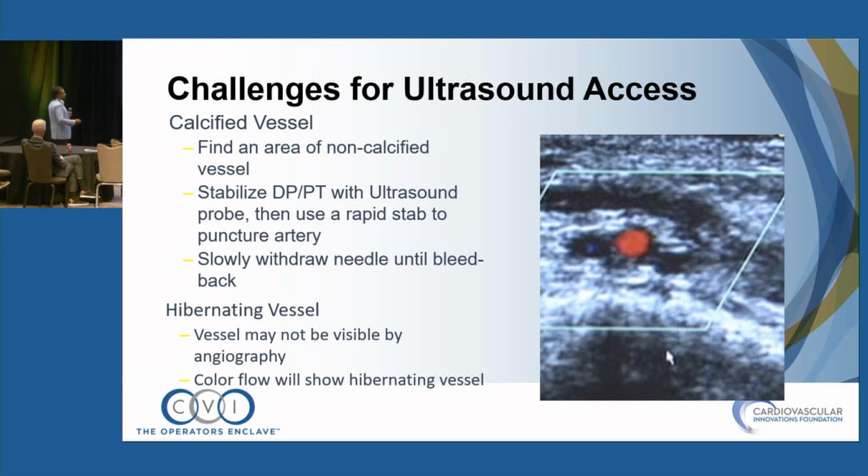That works. And then sometimes you just got to move your needle. Just find another spot. You can do that in the longitudinal view. That's really helpful to do it in that view, because then you can see the artery in different spots and you can get access. The other thing is shallow your needle a little bit more. So if you're more of an acute angle, it'll pop a little bit easier, whereas if it's shallow, it just kind of slowly glides in. So that's another technique, but that's probably going to be the biggest challenge that you have, calcium. And those are some tips and tricks to get around it, and 95% of the time, that's going to work.